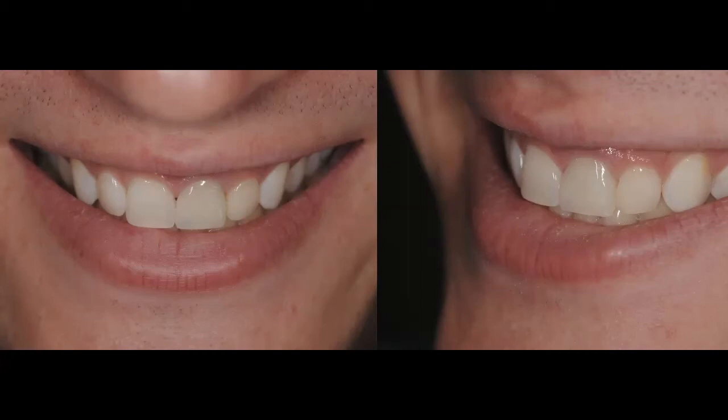If you have a lab technician that is not trained for highly aesthetic restorations, you give them all this information, they don't know how to use it. And that can be a problem, because this is the first restoration I got back.